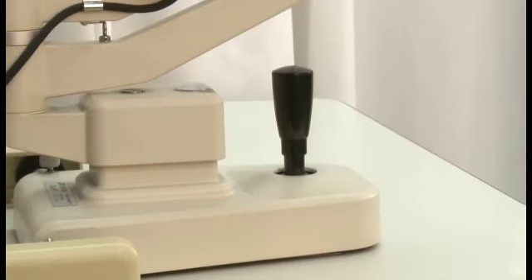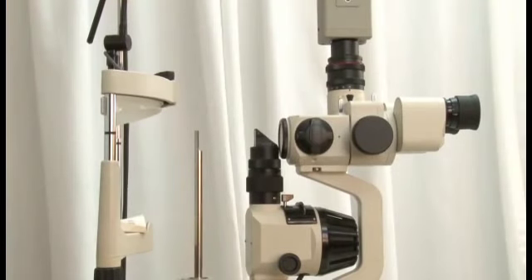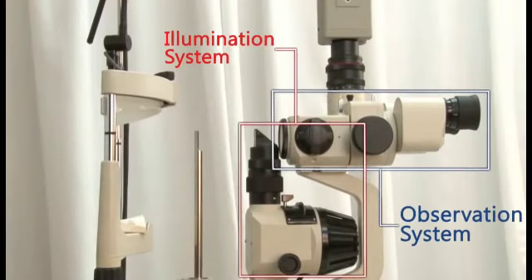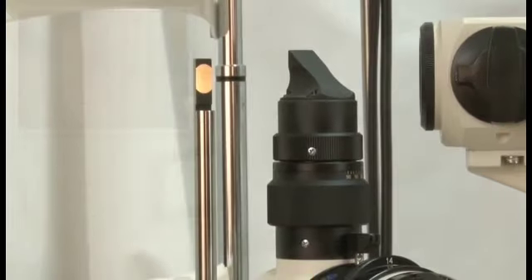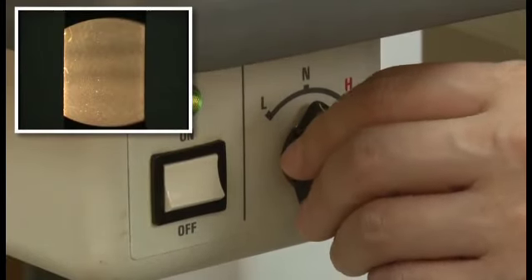This video will demonstrate how to use a slit lamp and perform different techniques. All slit lamps in the market have similar design. They have two basic components, an observation system and an illuminating system. The illumination system provides a precise and adjustable source of light.